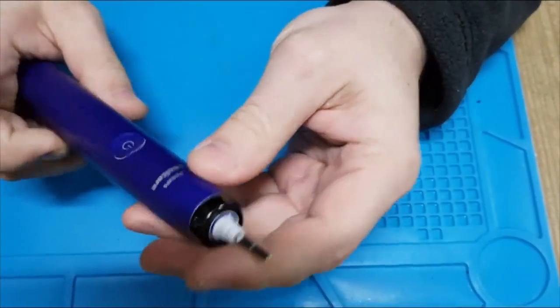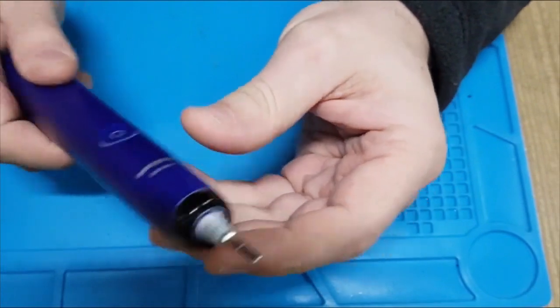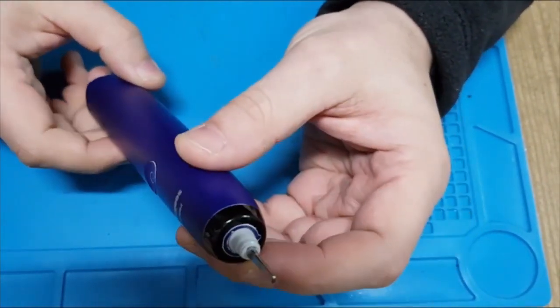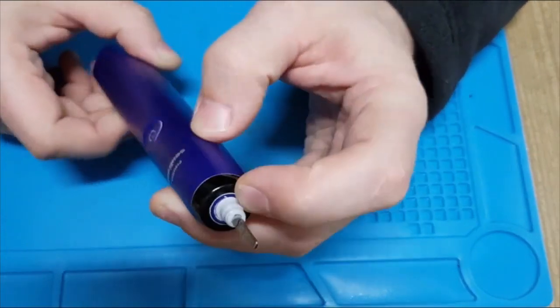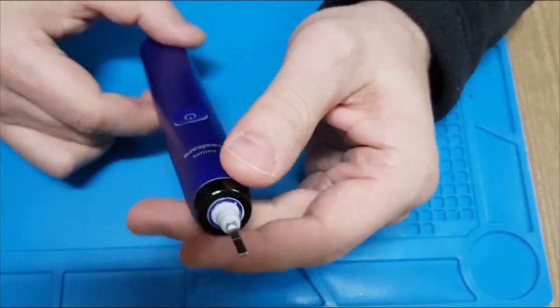I decided to share with you some of my experience that I gathered repairing these Philips Sonicare toothbrushes. It's quite a reliable toothbrush, but has some weak spots.